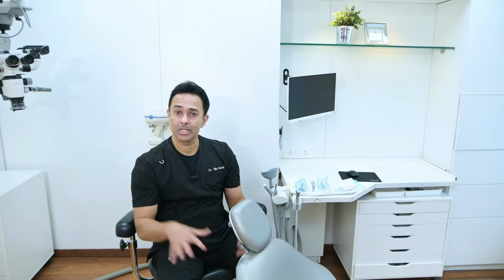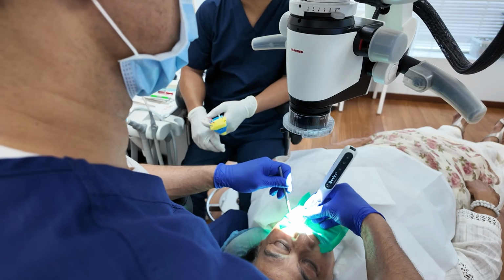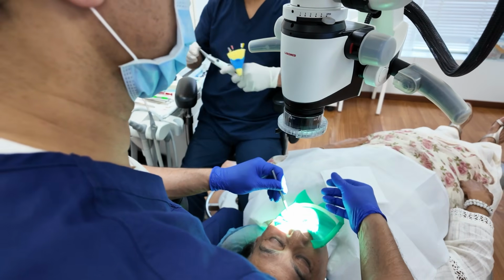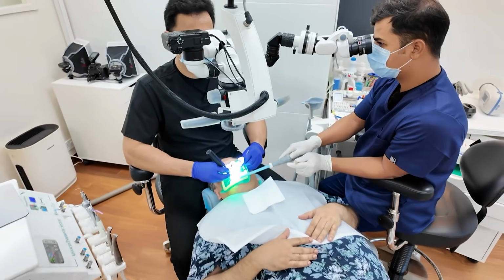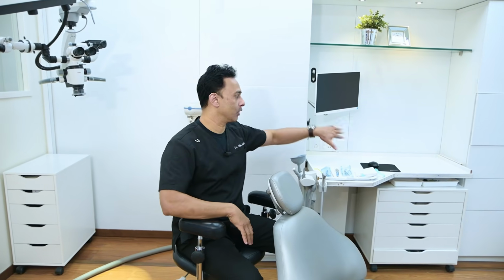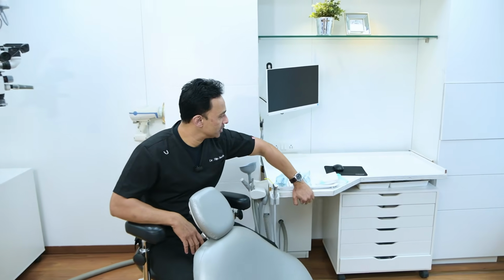We call it the circle of influence, which means the idea is that the operatory has to be designed in such a way that once you start the procedure and you start working on the patient, whatever the operator and the assistant needs should be at an arm's length. They don't have to keep getting up and reaching out for stuff. Everything they need should be in one place. That's the concept. So you have a back wall here, and you have a tray which is retractable.